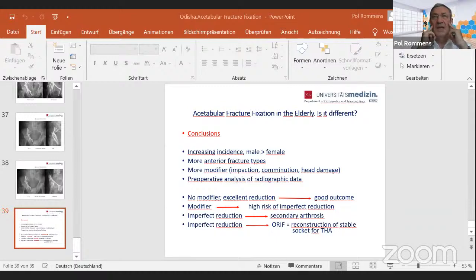Minimal invasive surgery. Yes, if the fracture is not very much displaced, you can do that and bring the parts together, but it is not possible to control the quadrilateral surface with that kind of minimal screw fixation, because this is a separate piece, it's very thin, it's displaced, and you cannot get it with a screw. You need a buttress plate, as I showed you. There are several on the market to buttress this large area. It is a large but very thin area so that the head cannot go medially anymore. You prevent a medial displacement after the osteosynthesis.